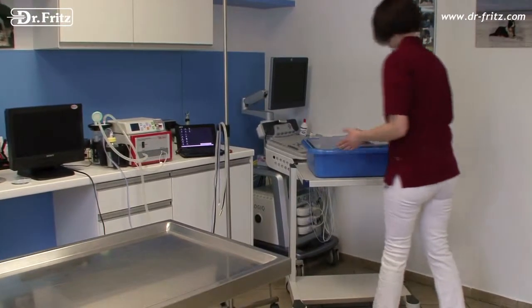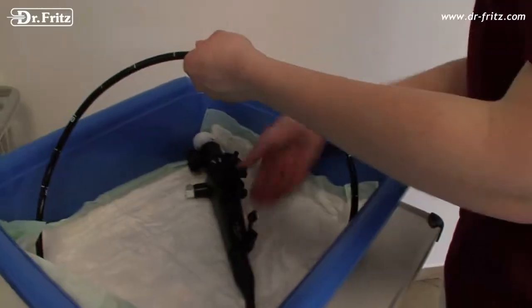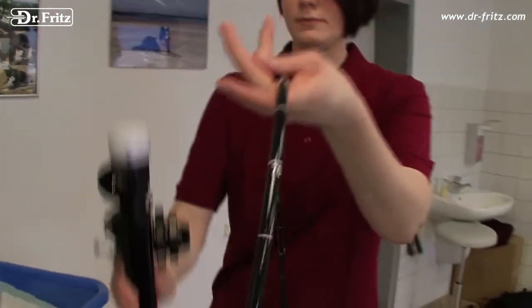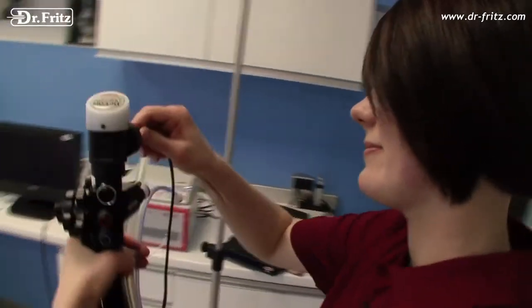The Dr. Fritz LED Video Gastroscope is designed for the veterinary profession. This system is completely independent from any other unit. Just connect it to a monitor and supply it with power.